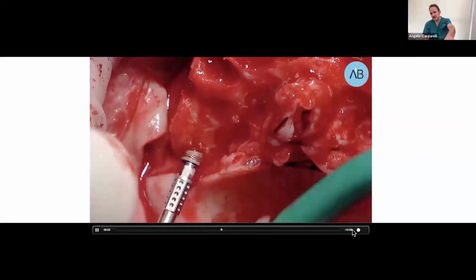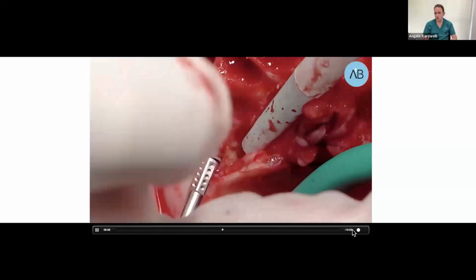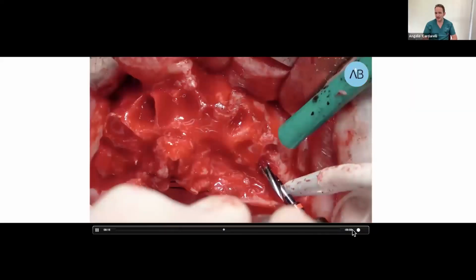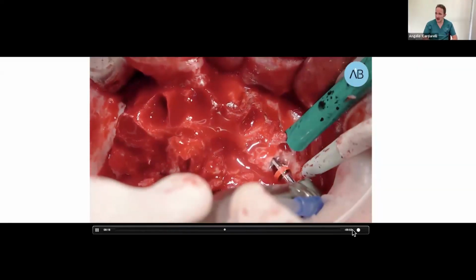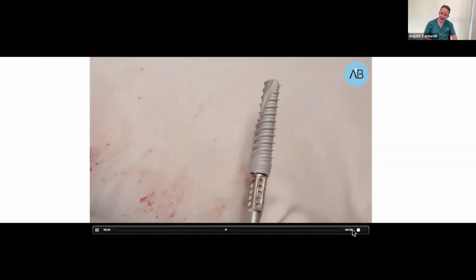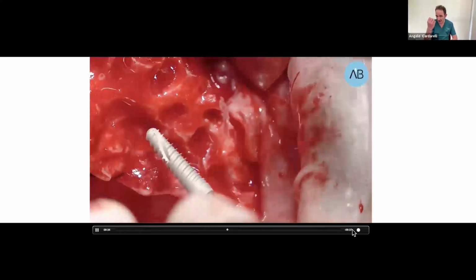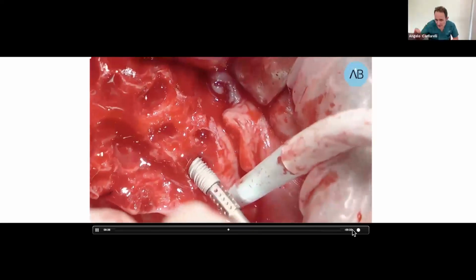The different thing is the prosthetic tool, because we have a conical connection. So just to change this, but we can use the same kit. And we can put below the same sequence on the left side, using the red one as the last drill. Then we can place the same implant, ion 3.75 per 16. You can see the threads of this implant. And have a look how we can have the primary stability.